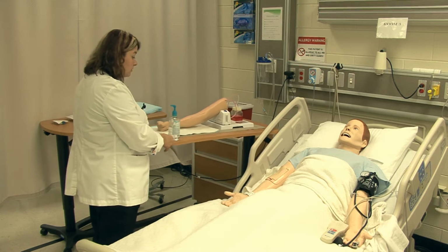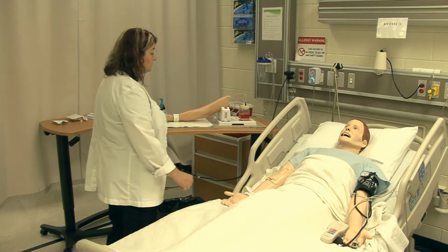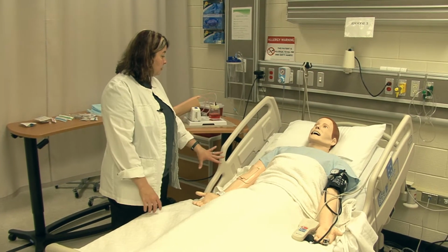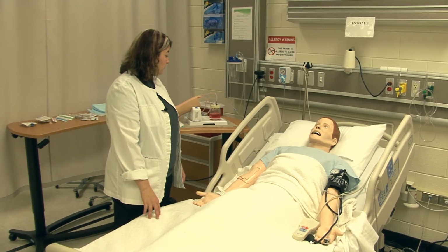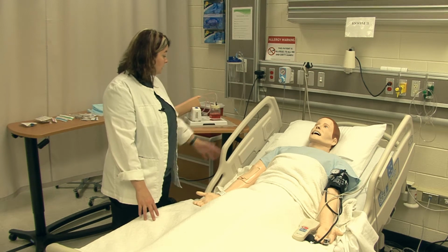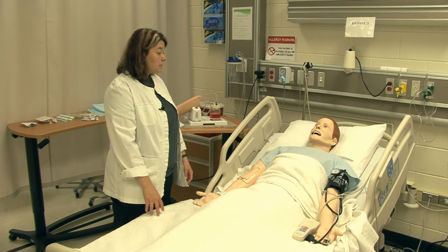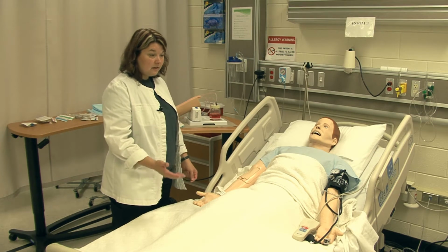Mr. Smith, your doctor has ordered for us to put an IV in, and he wants us to give you some IV fluids to keep the IV open. He's also got some orders for the IV fluids to have some electrolytes and things in it because your potassium's a little bit low. And so I've explained to him the reason for the IV and those kinds of things.